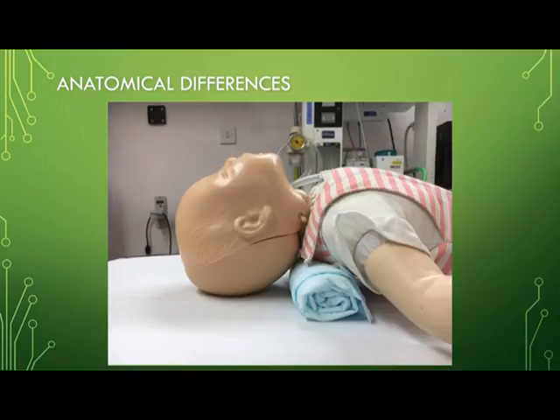If the infant is difficult to intubate, a rolled Inco sheet can be placed below the shoulder, as shown, to maintain head extension. This is especially useful in the neonate, who has low bodily tone and may be difficult to position, and has got me out of a number of difficult intubations in the past.